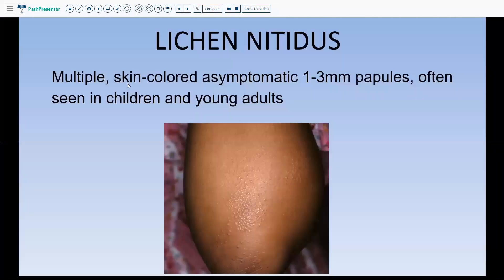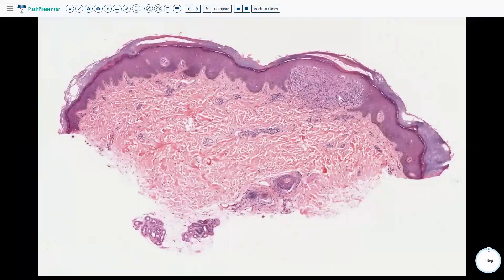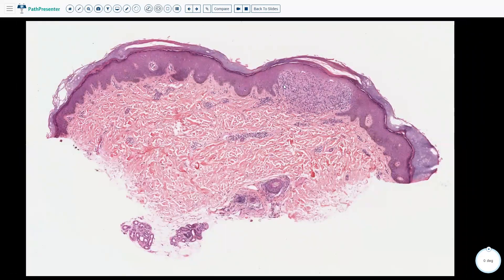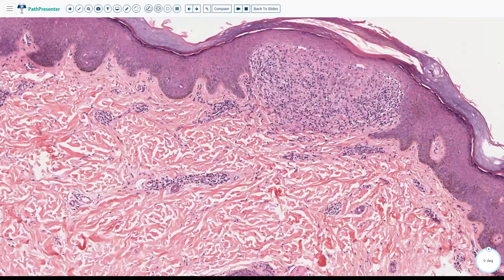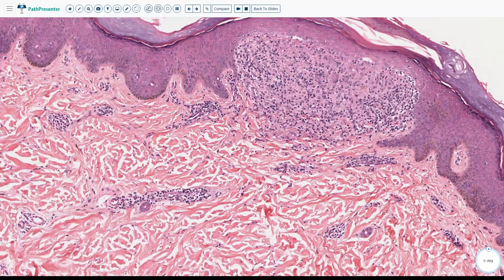In lichen nitidus, which presents with multiple skin-colored asymptomatic papules that are very small, often seen in children and young adults, the histology is also very classic with a ball and claw pattern. This is the ball of the infiltrate and these are the claws — the rete ridges are hugging the ball of inflammation almost like claws trying to hold it. This is usually limited to one or sometimes two rete ridges, within which you see a lymphohistiocytic infiltrate. A lymphohistiocytic infiltrate that is lichenoid, spanning one or two rete ridges with this ball and claw pattern, is very classic for lichen nitidus.